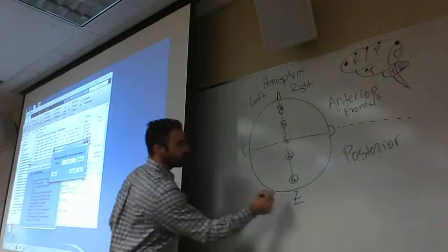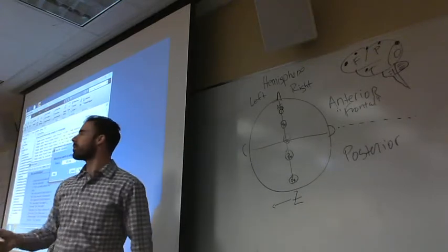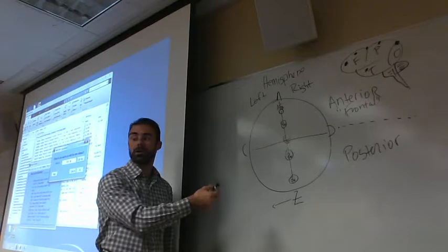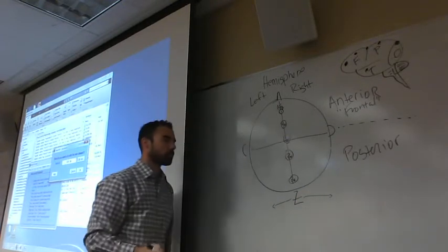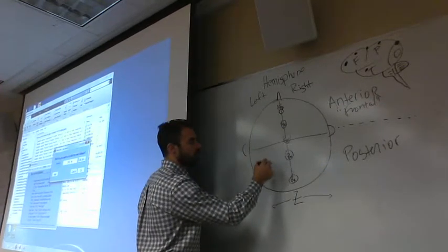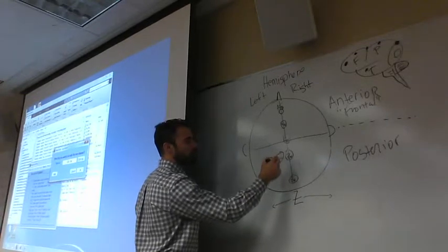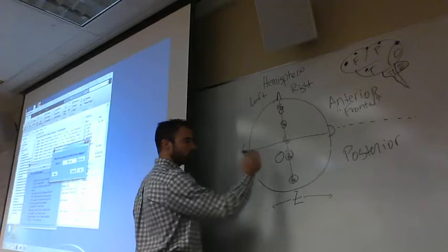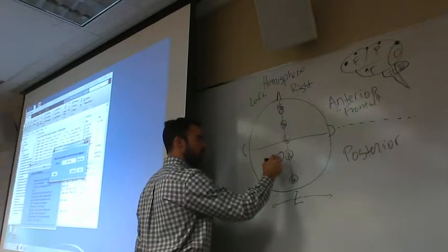If you move this way, we need a way to refer to those electrodes as you move laterally away from the midline in each direction. So let's start on this side, the parietal site. If you move one spot over here, instead of it being PZ, let's say it might be P1.